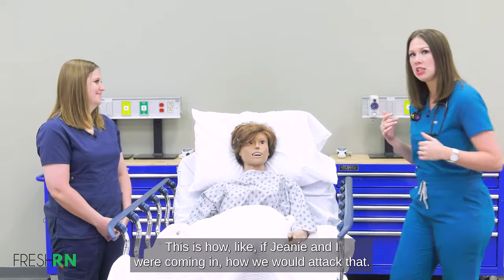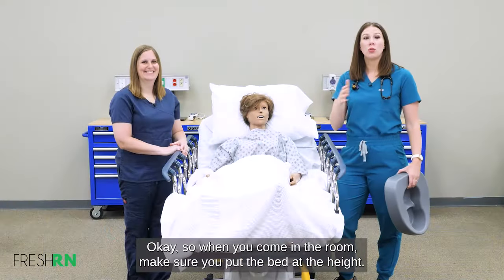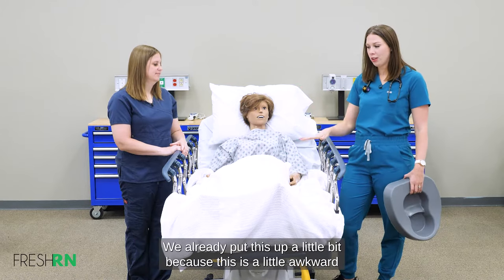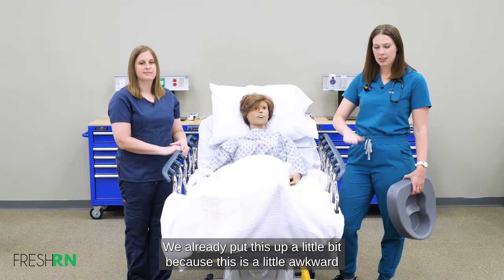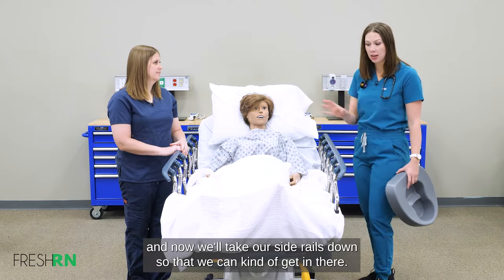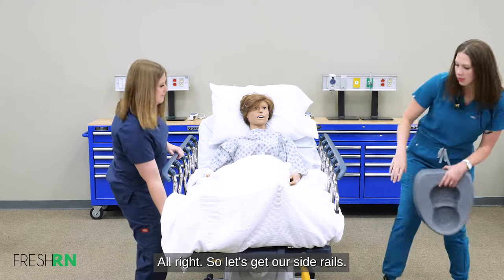This is how Jeannie and I would attack that. When you come in the room, make sure you put the bed at the height that's good for you. We already put this up a little bit because it's a little awkward pushing it up, so we went ahead and got it where we needed to. Now we'll take our side rails down so we can get in there.